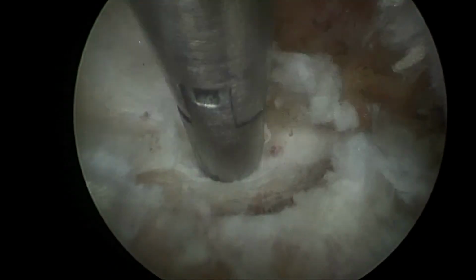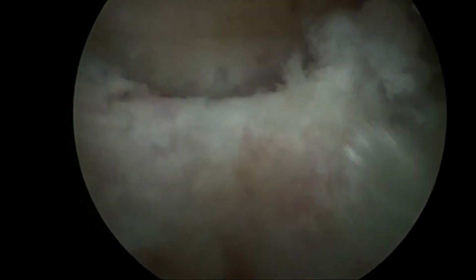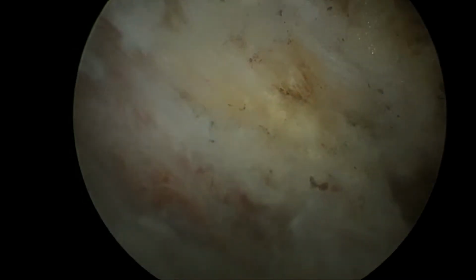I used the bipolar to feel around for hemostasis in order to shrink away tissues and to understand the anatomy.